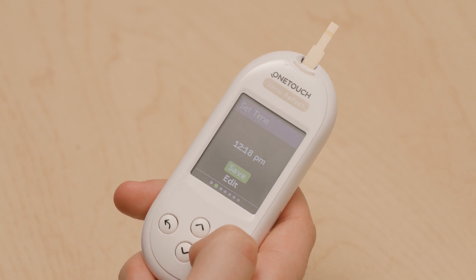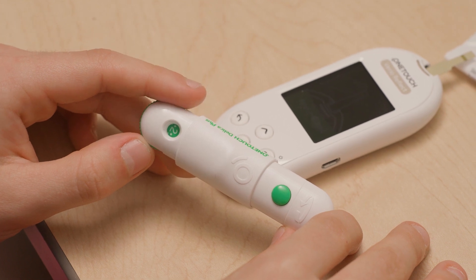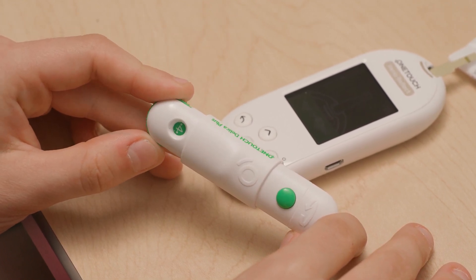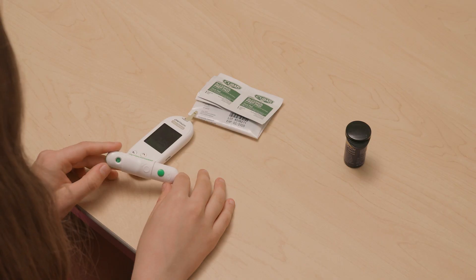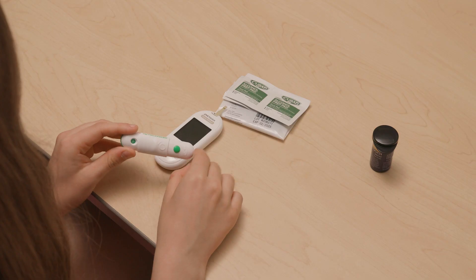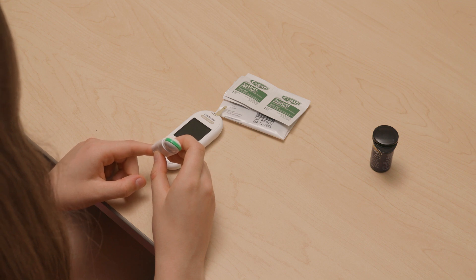Once the meter is set up, you will get the lancing device ready. This is also known as the poker. Set the depth of the lancing device — this is how deep the needle will poke. The higher the number, the deeper the poke. Set the depth by turning the end of the lancing device to the number you want. It's usually best to start with a 3 or 4. Even though a deep poke sounds more painful, we want to make sure the needle goes into the skin deep enough to break the skin and get blood.